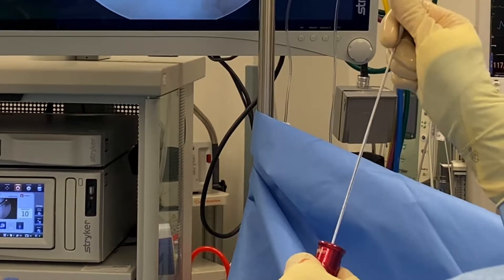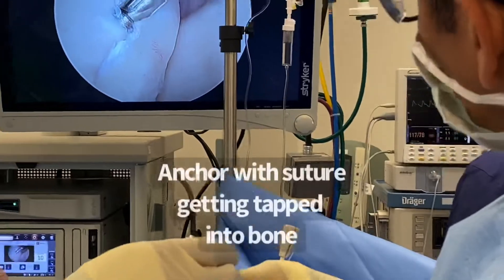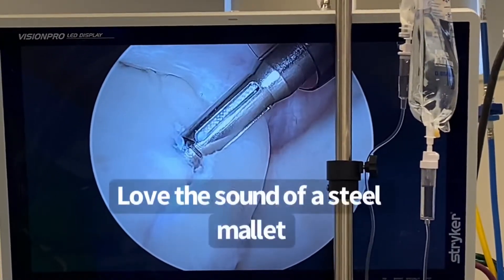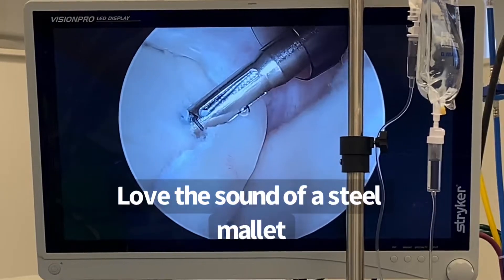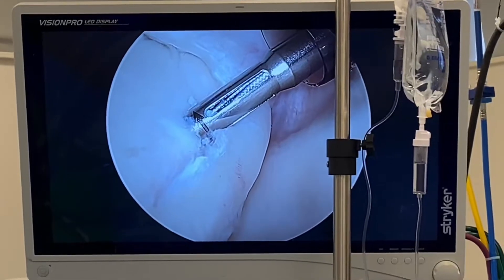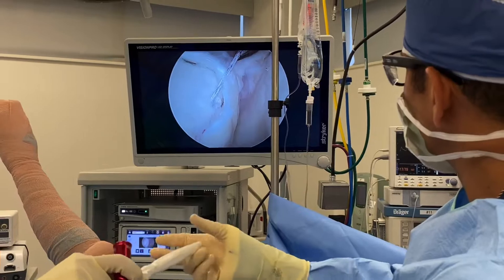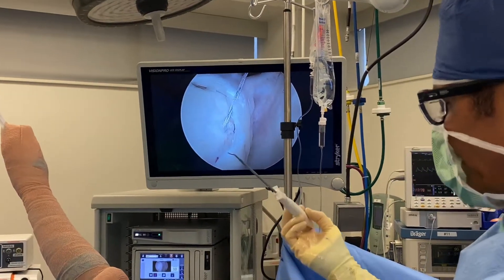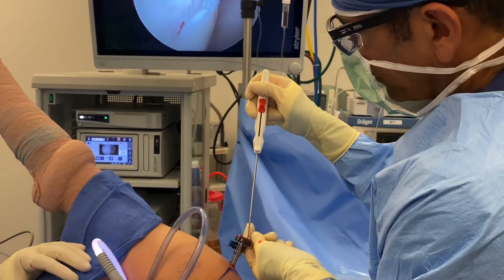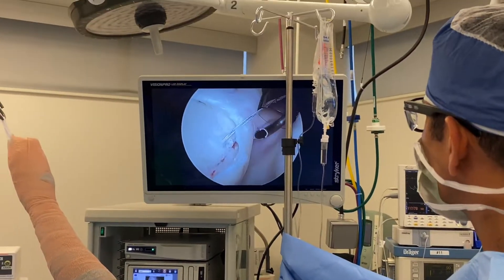This will be attached with an anchor. We just drill the pilot hole — the pilot hole's been drilled — sliding it in. It gets tapped into that pilot hole and engages the side of the pilot hole. I check the anchor and it feels really good.